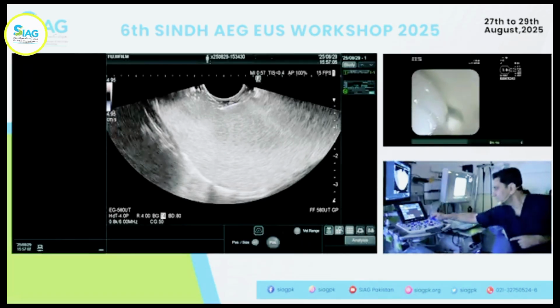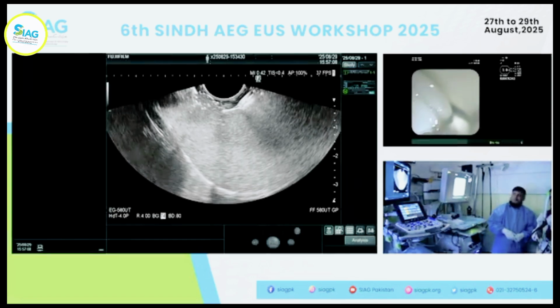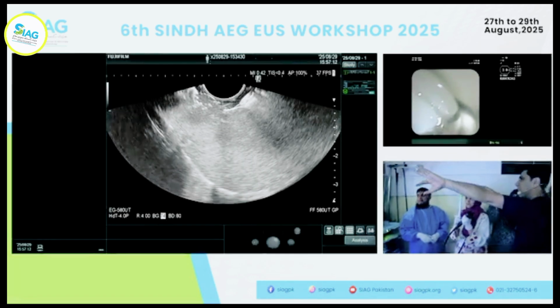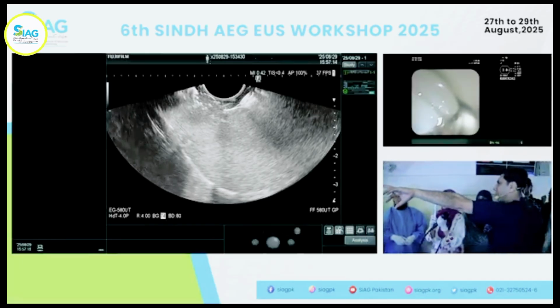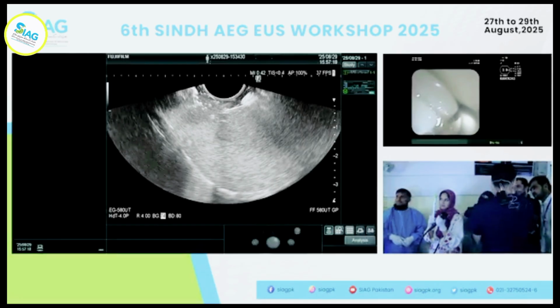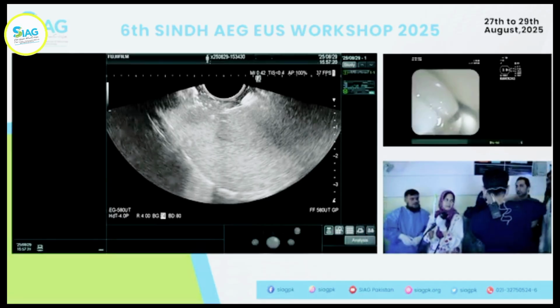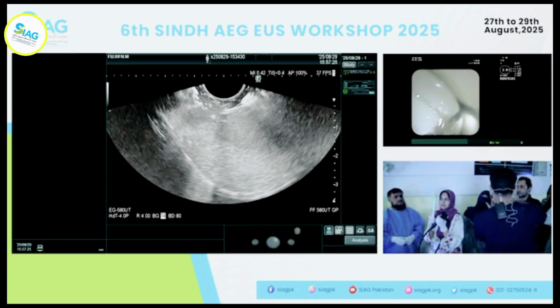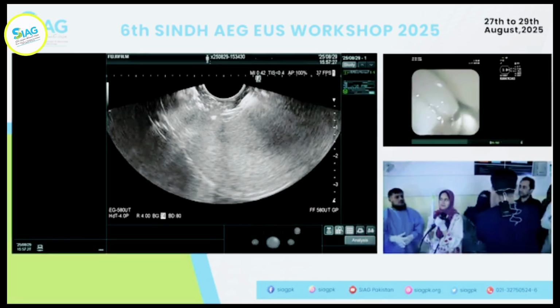I don't keep the Doppler on. No, so stop this, guys. Something incredibly important happened there. No, keep it there, bring it out. So what happens is, if you're not perpendicular to it, it's going to slide. Especially from the stomach, you actually have to make a good contact of the sheath with the mucosa.